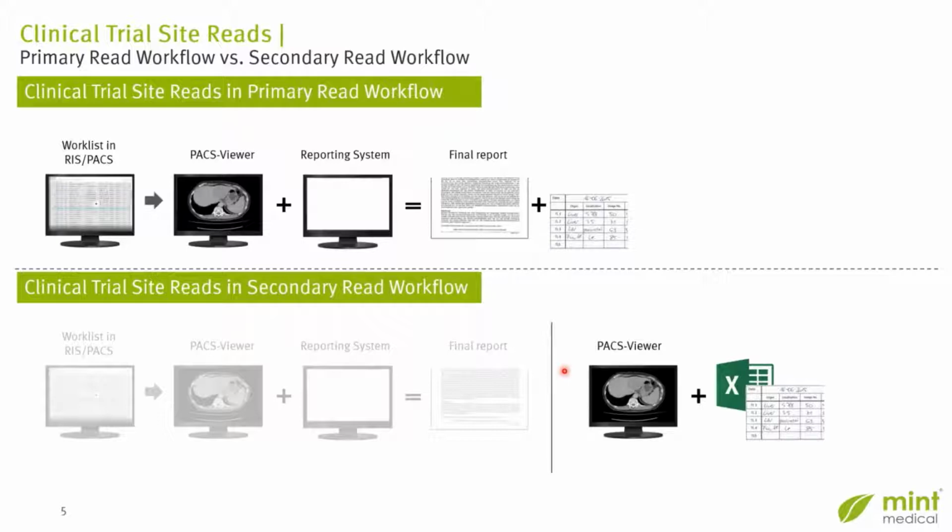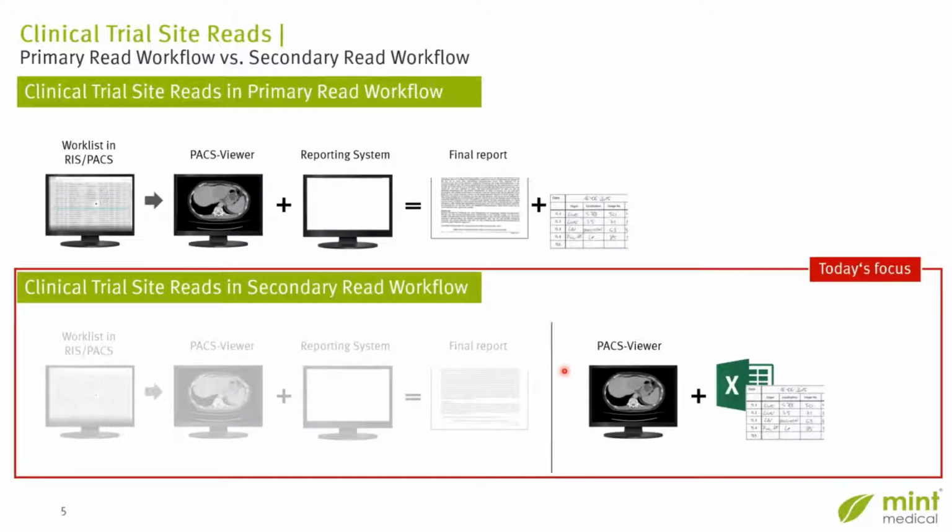On the following pages, we will now focus on the secondary read workflow, but we also have customers using the primary read workflow, and they're very successful in doing it. So if you are very interested in how to perform clinical trial site reads in primary read workflow, also let us know, and we will give you some more information on this.